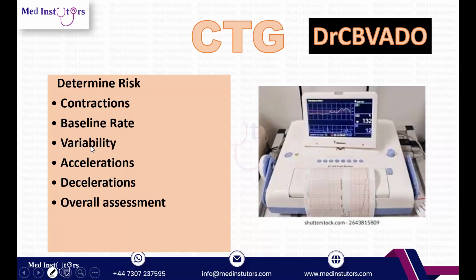Please. Thank you. So now we will be talking about CTG. The short form here is DR C BRAVADO. DR means determine risk. C is contractions. B is baseline. V is variability. A is accelerations. D is decelerations, and then overall assessment of the CTG.